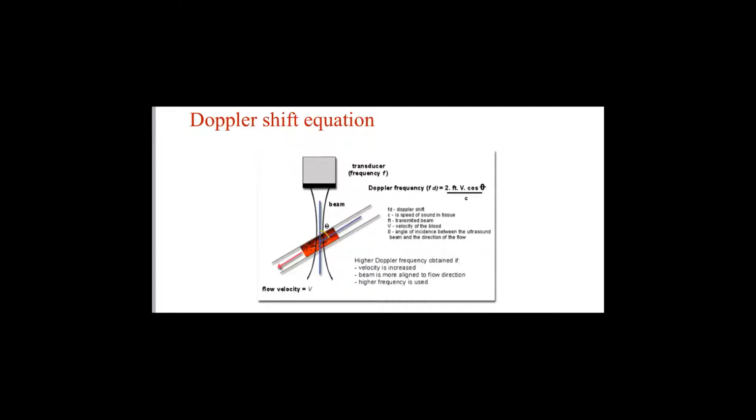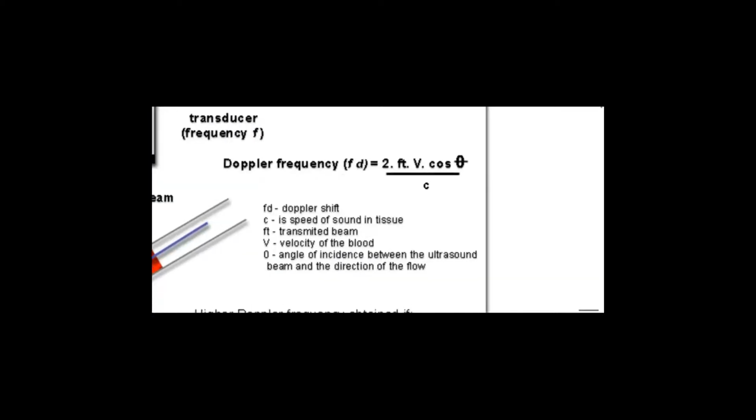While in adults, you are going to trade off the higher frequency for penetration. Therefore, you are going to use lower frequency than the pediatric probe for the sake of achieving better penetration. This is one important fact you should know. Okay? Now, look at this equation.